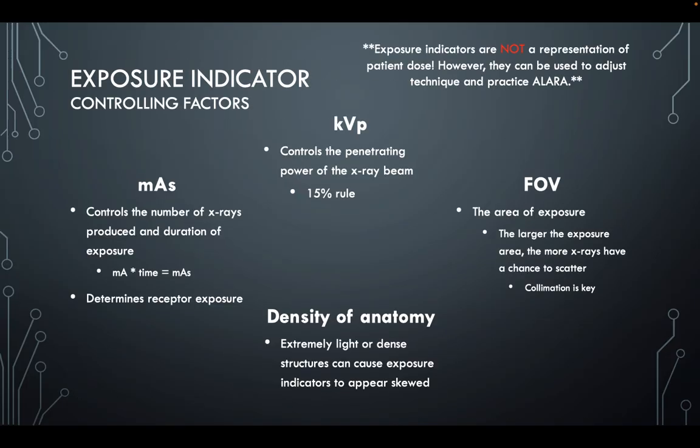Okay, exposure indicators. Remember, not a representation of patient dose. However, they can be used to adjust our technique and stick to ALARA and ALATA. The controlling factors for our exposure indicators are going to be our mAs, our kVp, the field of view, and the density of the anatomy.